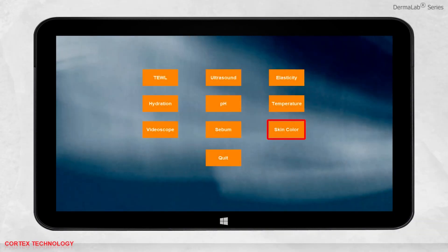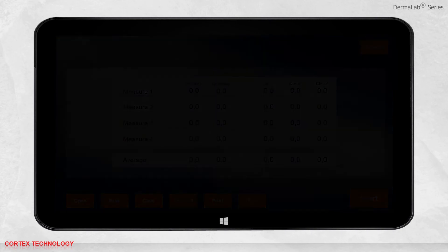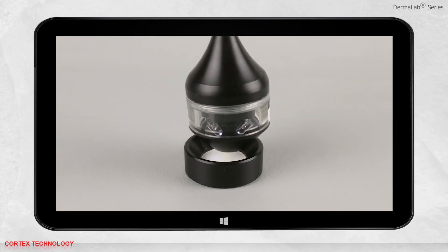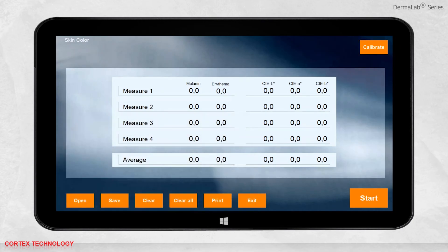When you are ready, remember to calibrate the probe for best possible results. Place the probe in the calibrator and press calibrate. The probe will flash once and the calibration is complete. You are now ready to make a measurement.